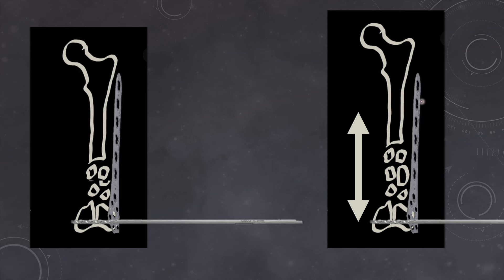Once we are sure that the length is perfect, we can give a stab incision proximally at the level of the topmost locking hole and pass a drill bit at that level. Now the drill bit will remain secure in the proximal part and one drill bit will remain secure in the distal part. This plate and drill bit assembly will prevent any overriding at the fracture site — meaning the fracture is not going to collapse now. However, it can still angulate, as we'll see in the coming slides.